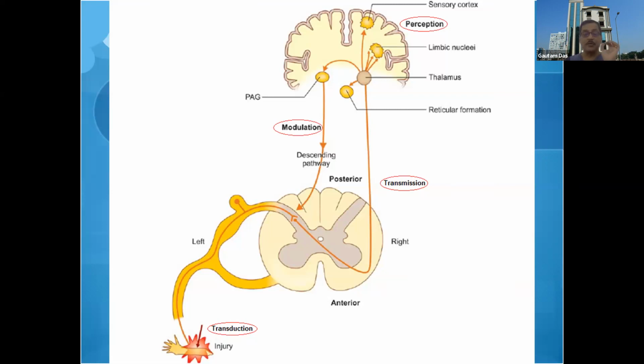Alternating current is needed for stimulating the nerves, and the frequency of the alternating current means how many times it changes its direction. I just told you alternating current means it changes its direction. So how many times it changes its direction is the frequency of the alternating current. It is denoted by Hertz. So this is a rule you should remember. Have you noticed, when you are doing motor stimulation, nerve stimulation, how many Hertz of current you deliver? Normally 2 Hertz or even 1 Hertz.